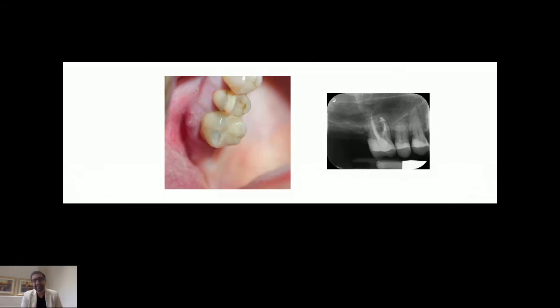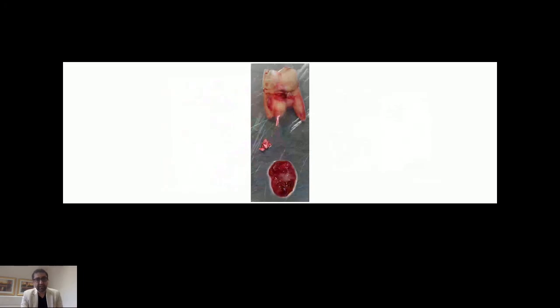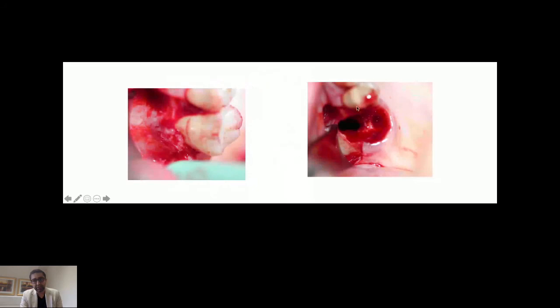So let's plan this case. Let's do the case slowly, no rush, in a better way. Because we very much knew that the moment we're going to take the tooth out, we will be in the sinus. The oro-antral communication is going to be there. So we did take the tooth out, removed all that granulation tissue, and you can see, as we mentioned before, the oro-antral communication, it's there. No problems. We will repair it and then later on place an implant in there.